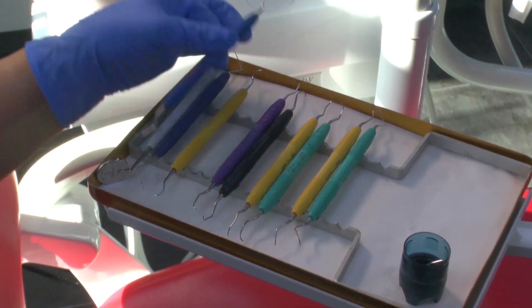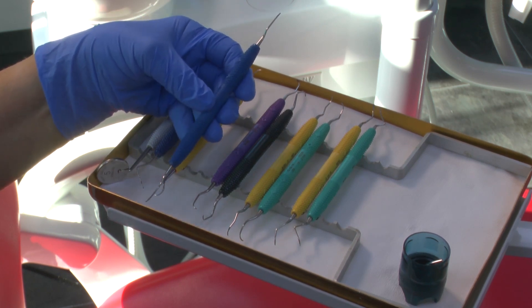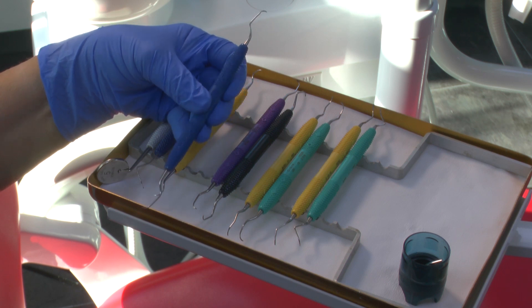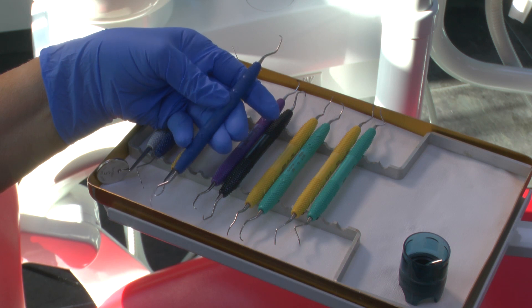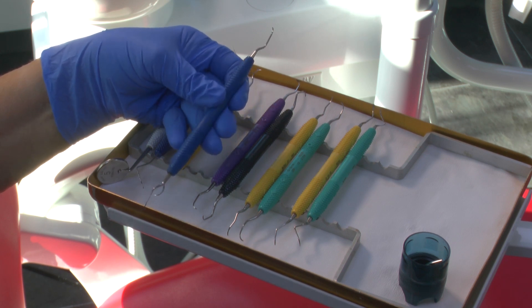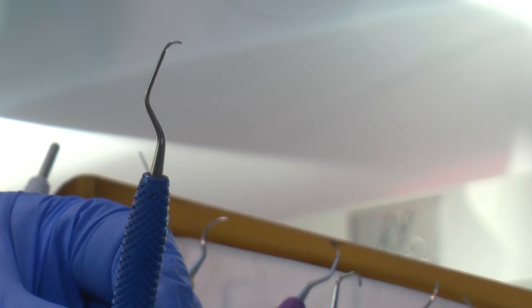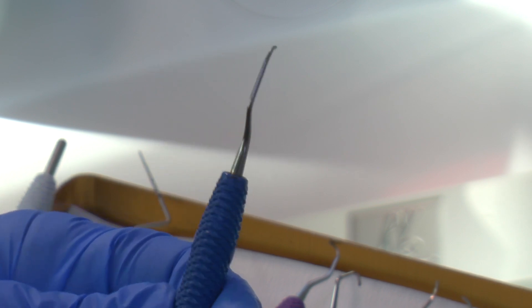This one is a Langer — it's not a Gracey. It's got a blade on each side of the toe and it's particularly nice for routine maintenance visits when you're wanting to quickly remove calculus from the lower anteriors, because you don't need to remove it and change to another instrument. This is a Langer 5-6, again by PDT, and it's quite a favourite instrument of mine.